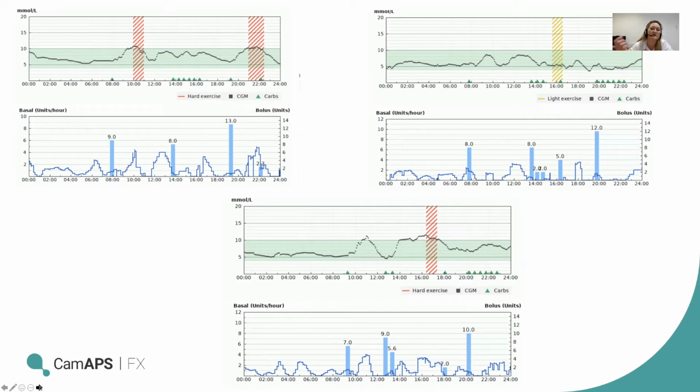And I think what you need to do is just experiment with the split. What you would want to look at and see is if the glucose peaked, if you had more of a peak up front, then you might find, say you were giving 70% up front, but actually it still rose more than you'd like, so took you above target initially, that you might end up thinking, okay, I actually still need more. I need 80% up front, or checking your carb ratio is right, if that initial amount doesn't keep you where you want in the first place. So that's just another thing to think about.